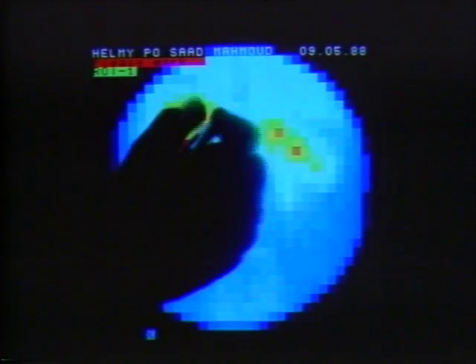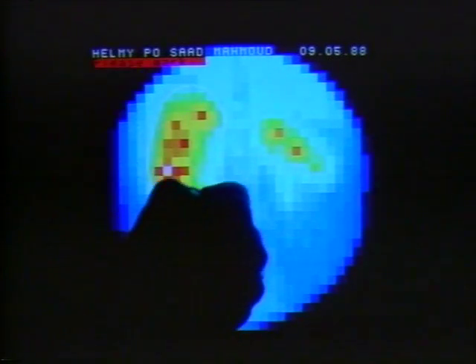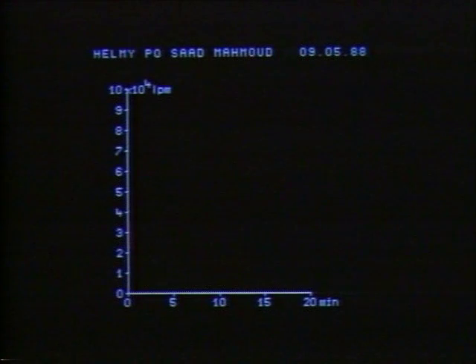Replacement of the ureter by an isolated segment of small intestine may be indicated for recurrent renal stone disease or for correction of long segment strictures of the ureter. This is the radioisotope renography of one of our patients. It demonstrates an obstructed left kidney not responding to diuresis.